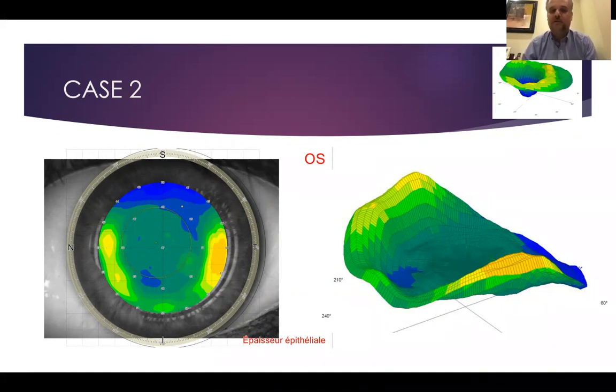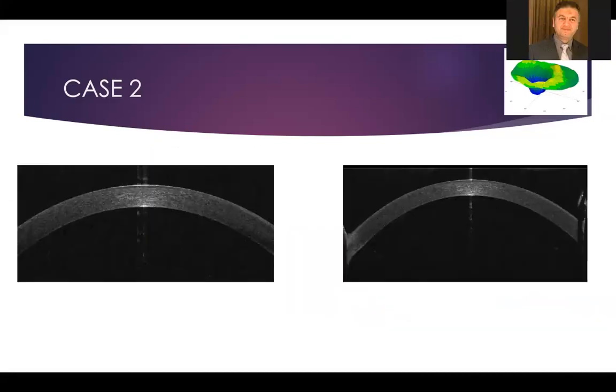So with -4 in this case, I will also not go for PRK. I will do nothing. Maybe intraocular surgery or nothing, but no corneal laser vision correction. Dr. Yasser, will you consider it as a keratoconus or just a suspect? It's an early keratoconus. Actually, it's very difficult to consider it.